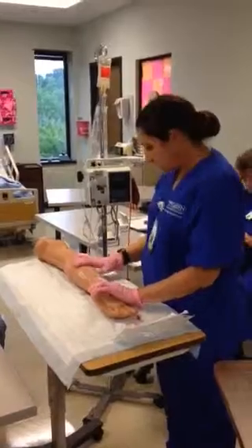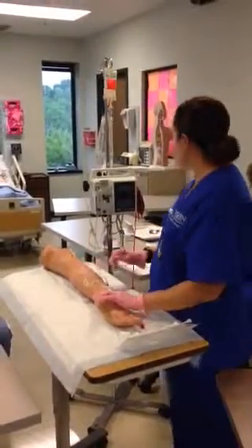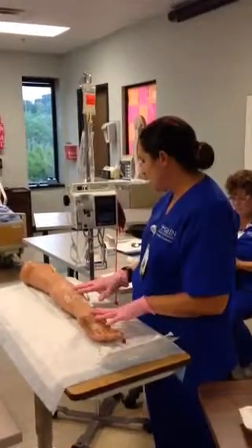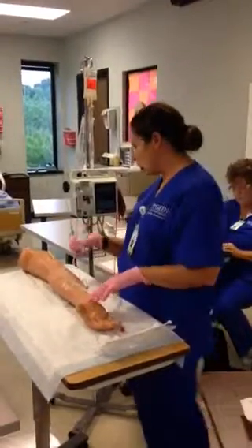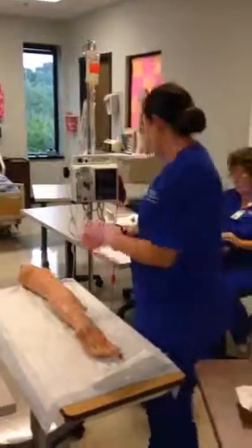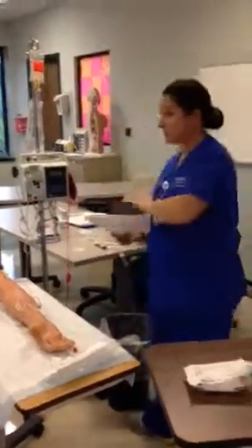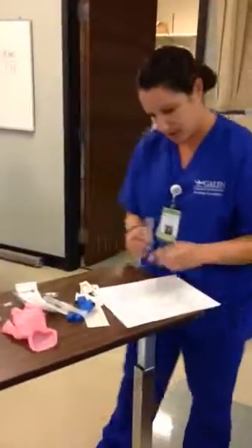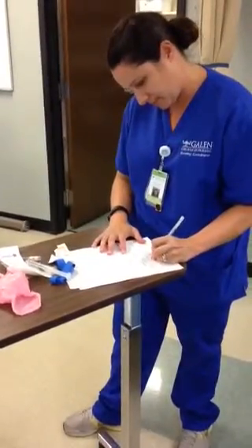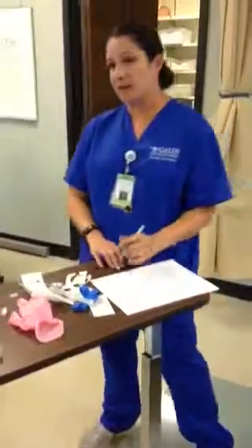How you doing, Miss Pearl? Is that okay? That IV site seems okay? That's not bothering you at all? All right, well, it'll take about an hour for that to run in. So let me know if you need anything. Here's your call light. I'll put your bed back down low. Here I'm leaving the patient's room. I'm gonna document here that I gave this clindamycin. And then I would also write a narrative note in this patient's chart that I started an IV in her right forearm, a 22 gauge, and she tolerated it well. That's it. Done.